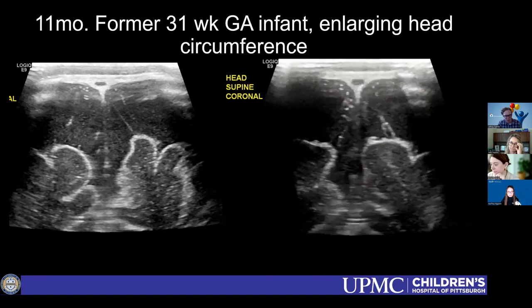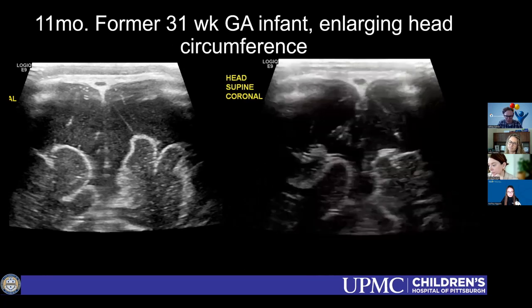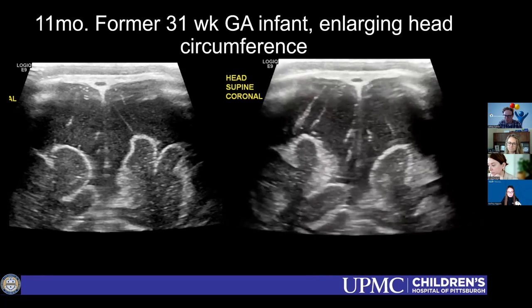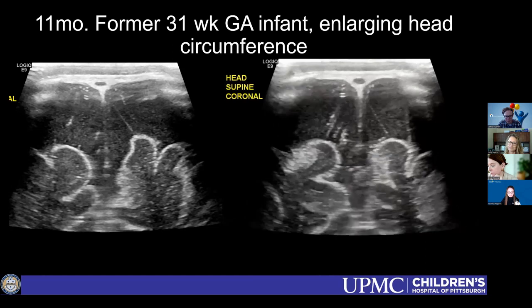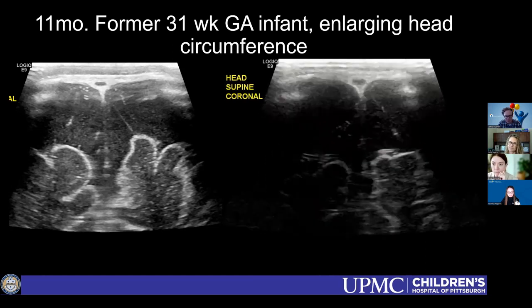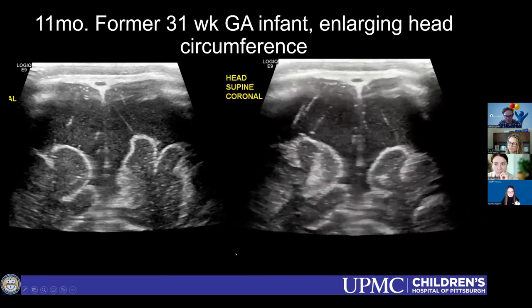Yeah, that was one other thing when we were deciding to implement these extraaxial space measurements. Kind of the same thing we were talking about. We ended up deciding to do it in all kids, because if you only pick a select few patients, it gets inconsistent with the sonographers remembering to do it. But we do it on these preterm infants now that we're doing it for other purposes. And there actually is a paper about sinocortical width, if it's over, I think, 3.5 millimeters, then that has a poor long-term developmental outcome. And like you're saying, I think it's describing underlying atrophy.